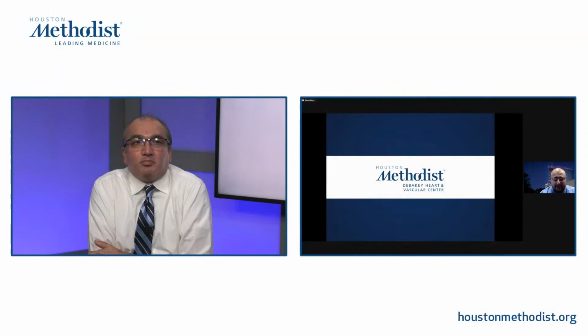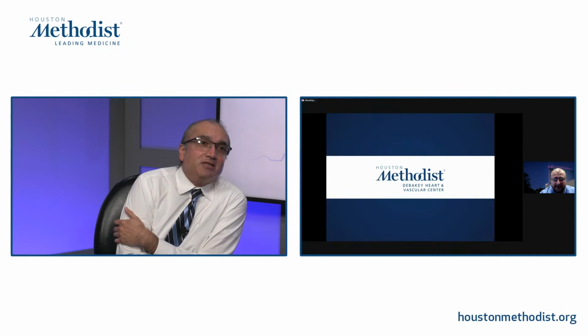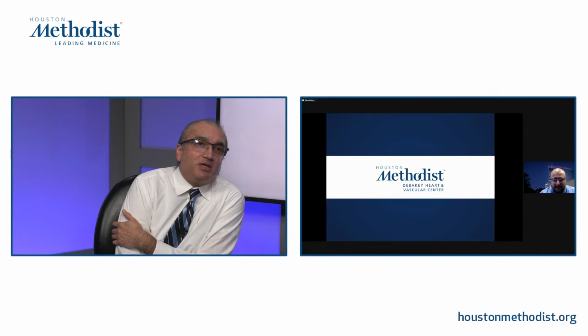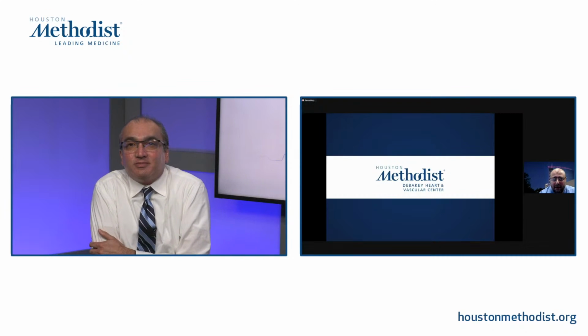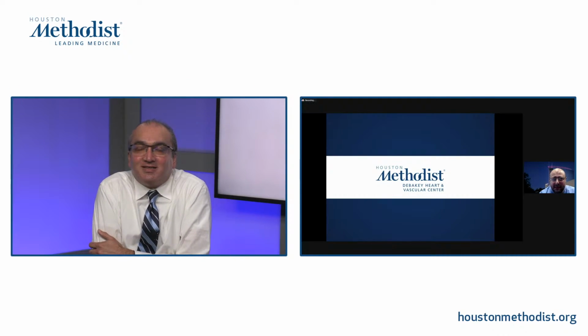Okay, great. So there's another question from the audience here as well. It says, does a negative monoclonal antibody workup plus highly suggestive PYP study exclude necessity to perform organ biopsy to confirm ATTR amyloid? Yeah, I mean, right now this is being proposed as the non-invasive biopsy for amyloid. So if you've done SPECT-CT, you have negative kappa and lambda, and you're sure that there is no AL, and you have a diagnostic PYP, yes, you can potentially skip biopsy and proceed to therapy in these patients.